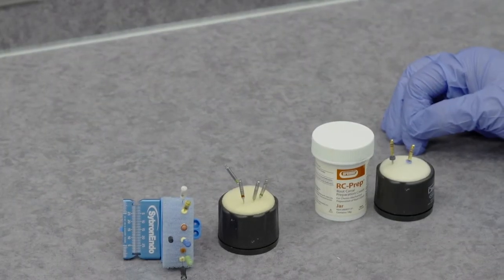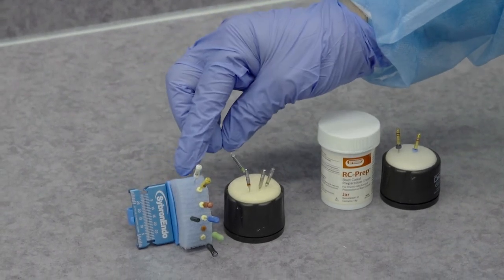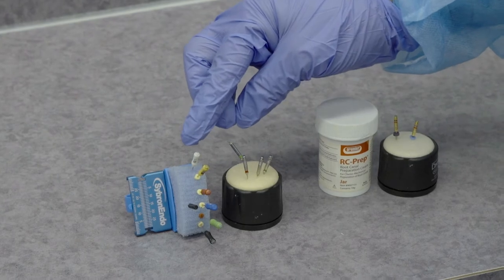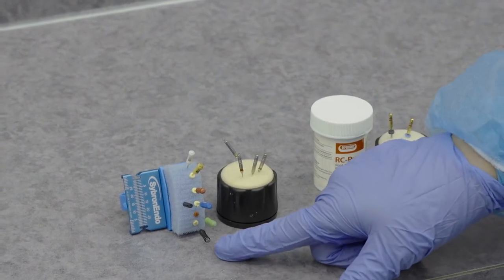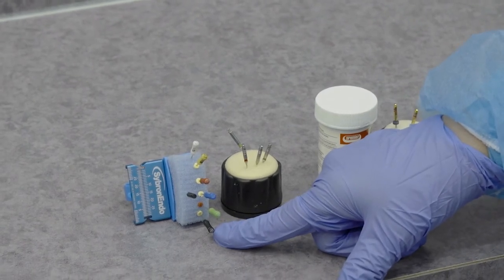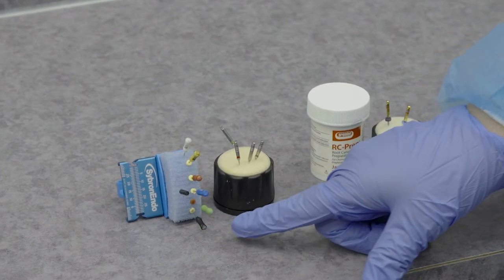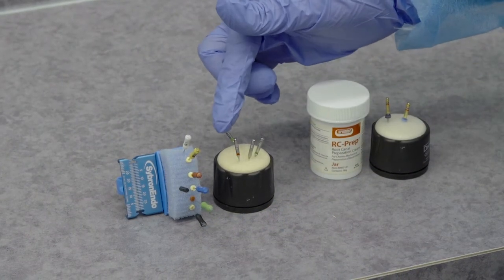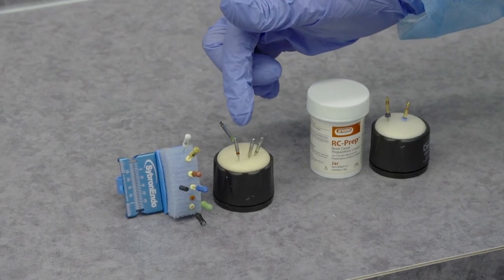So within the endodontic procedure, we utilize endodontic files from the smallest, which is a size 15, which is a white, to the largest within this procedure. There are many types of files, but in this procedure it goes up to a size 40, which is a black endodontic file. We're utilizing also the Gates Glidden, which is size 2 to size 4.